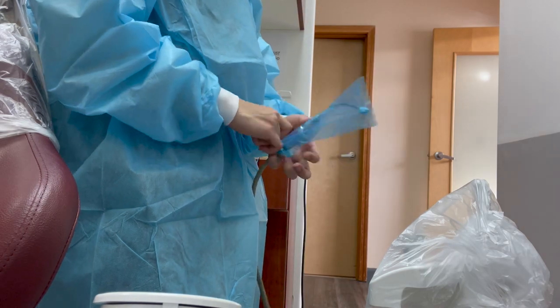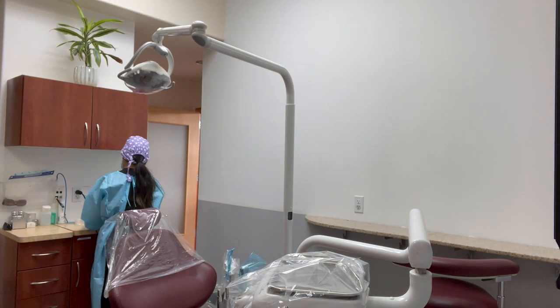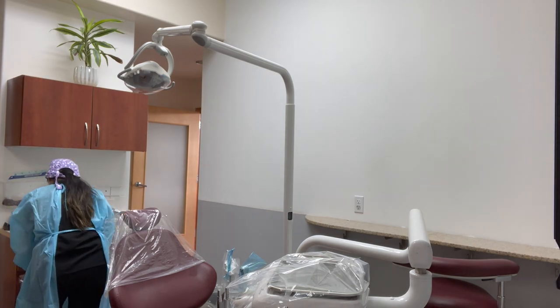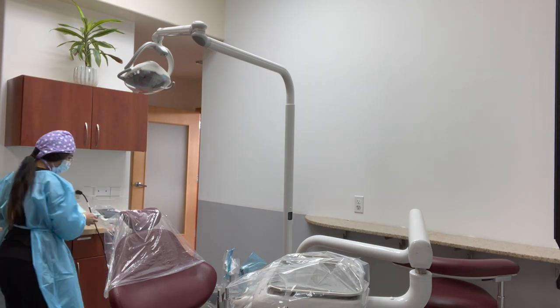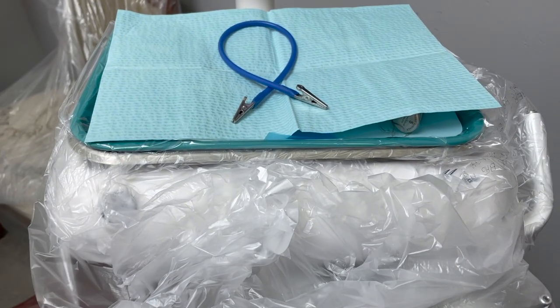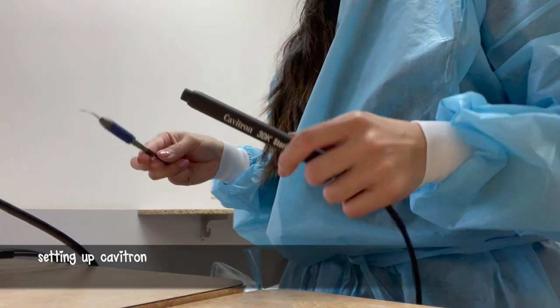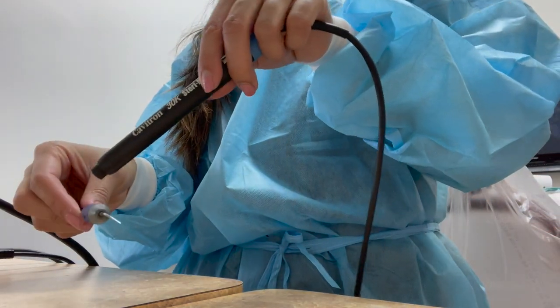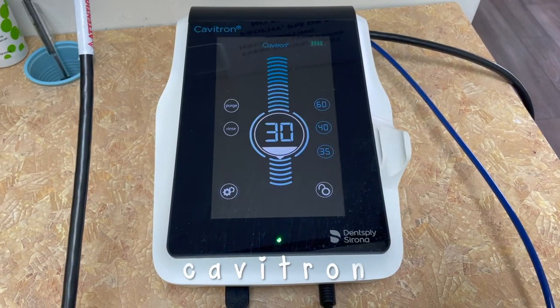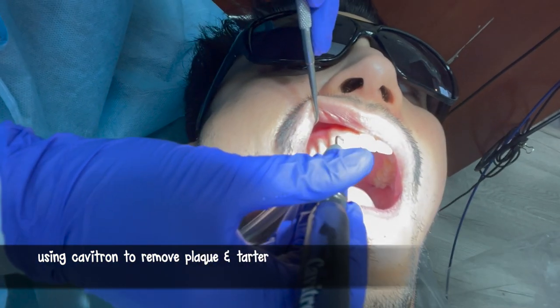I am setting up the saliva ejector onto the suction — these are disposable and we get rid of them after every patient. I'm placing a cover on this. I am doing the same thing with the air and water tip, placing it onto the unit and then putting a cover on it as well. Now I am placing the tray that I have set up onto the unit and covering it up with the bib. This is what the finished setup looks like. I just attached the cavitron sleeve onto the cord, and now I am putting some water on the cavitron tip and attaching it inside of the sleeve.